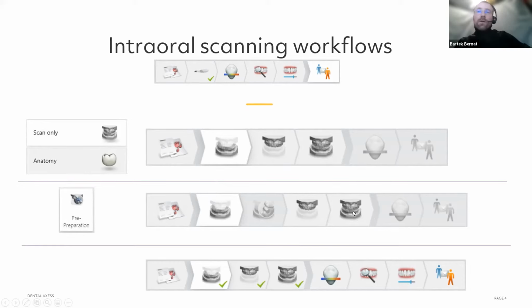Of course, if you have your preparation in the upper jaw, this sequence is going to change accordingly. Yeah, so this is the full example here. You can see at the very bottom how it looks when all of the scans are in.